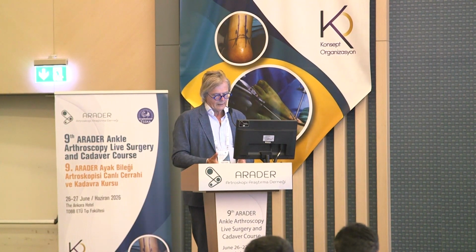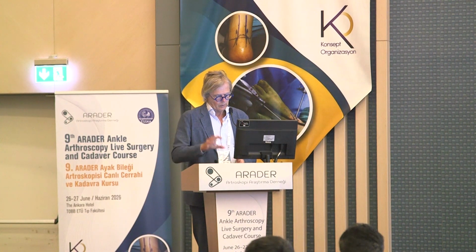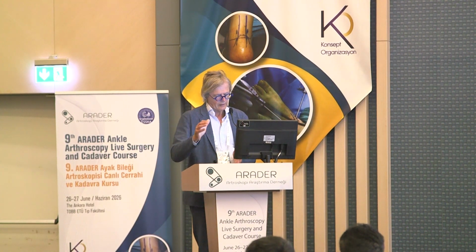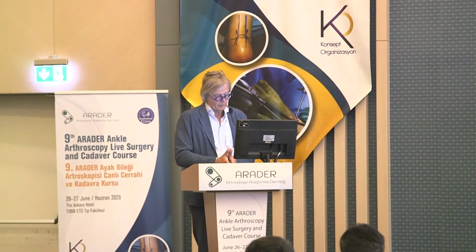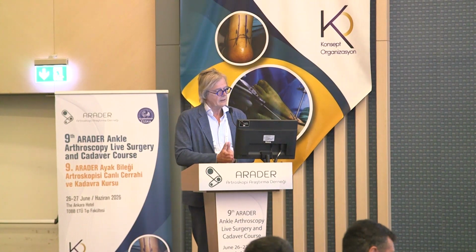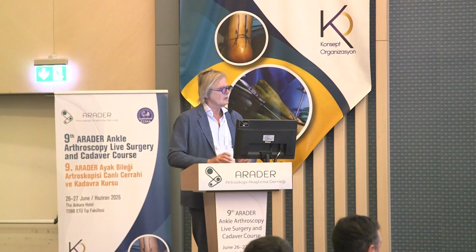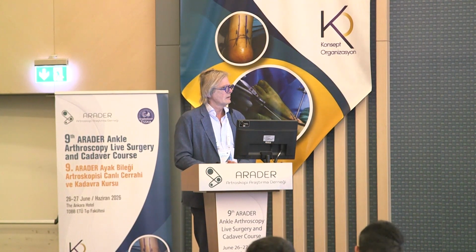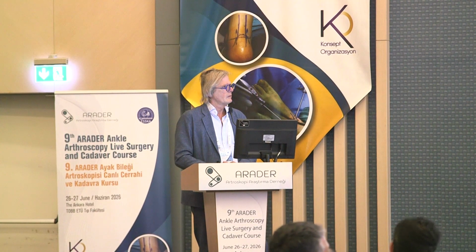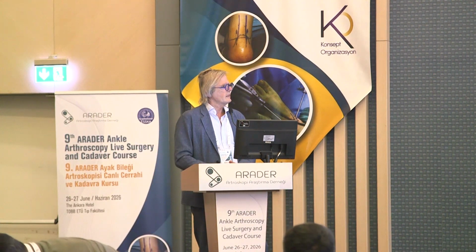So those post-traumatic cases, post-fracture, post-supination trauma, post-lateral ligament rupture, if they have limitation of motion, and that's their problem, then I do combined anterior and posterior arthroscopy. Release posterior, taking away the impediments in the front. A very rewarding procedure. Is it your routine for post-traumatic cases, both the anterior and the posterior at the same time? In fact, yes.